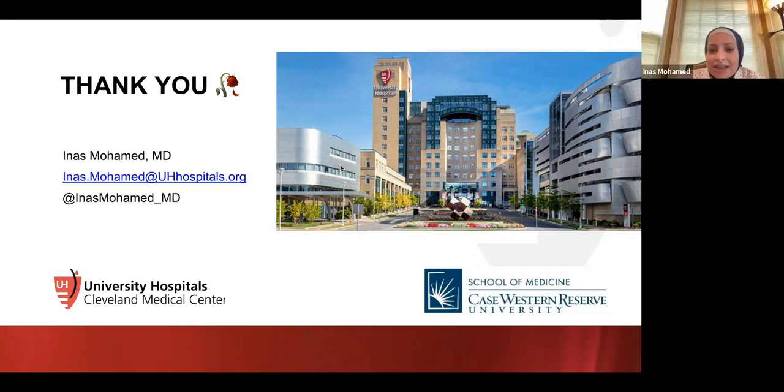Yes, I think somebody asked me a question. EOVIST is a totally separate study. In our protocols, the routine liver uses MAGNEVIST, which is 99% of the cases. EOVIST is just for problem solving. We give it instead of the gadolinium to solve a certain problem, like focal nodular hyperplasia.